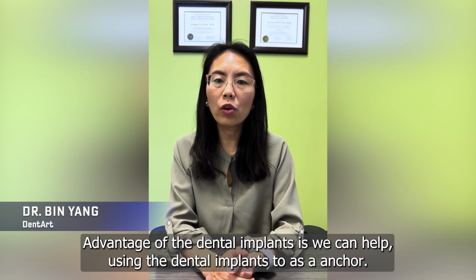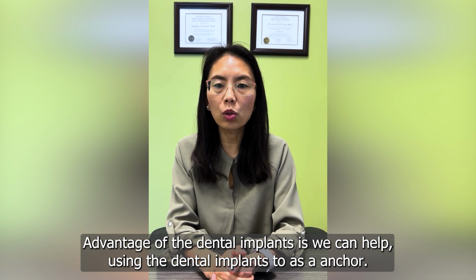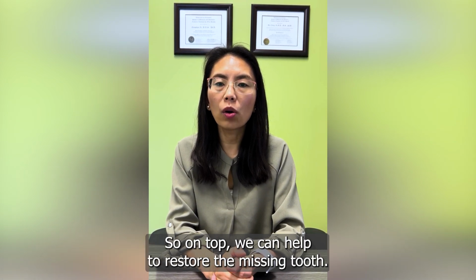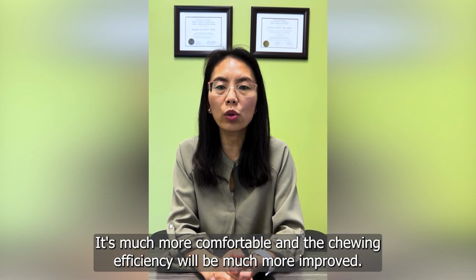The advantage of dental implants is that we can use them as an anchor. On top, we can restore the missing tooth. It's much more comfortable, and the chewing efficiency will be much improved.